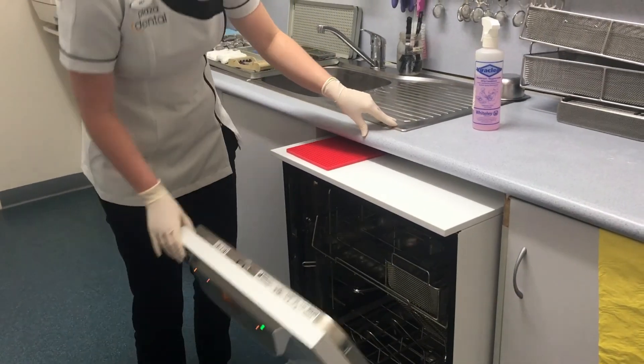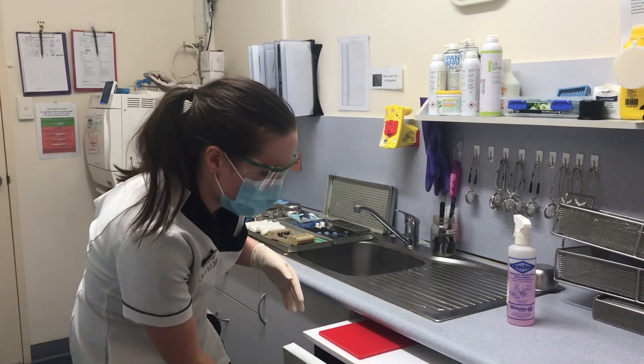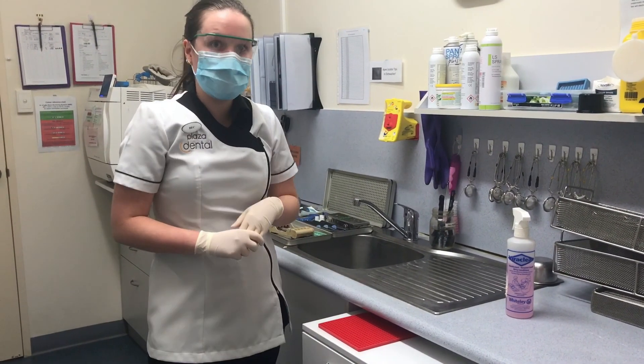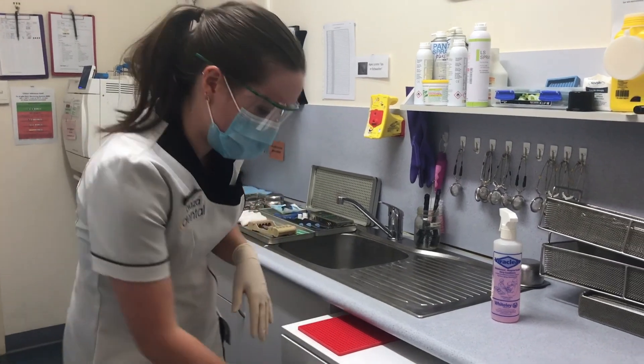The dishwasher itself takes about an hour for a cycle, so the whole processing of the instruments can be quite time-consuming, but it is the most important part of dental assisting.